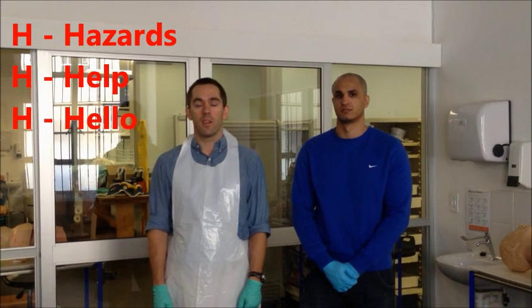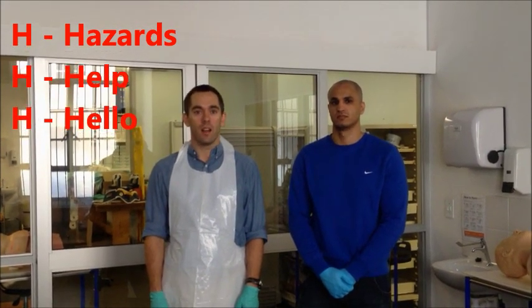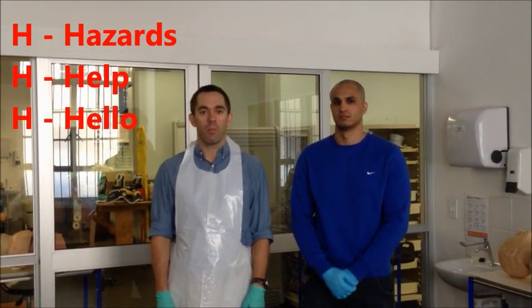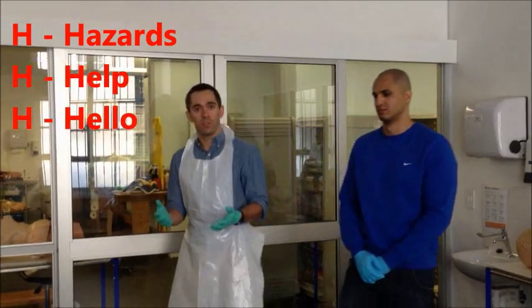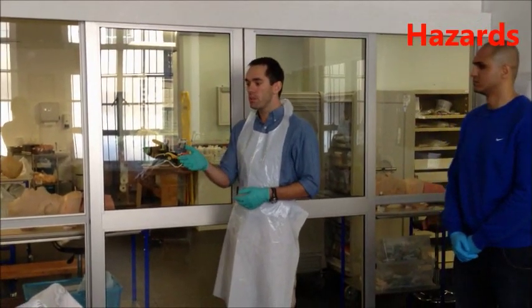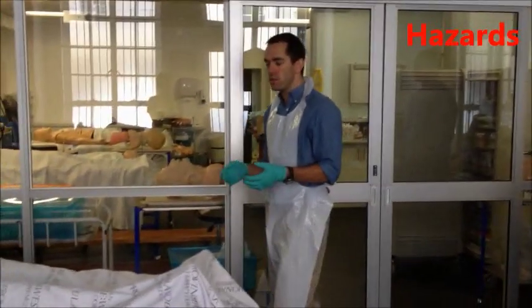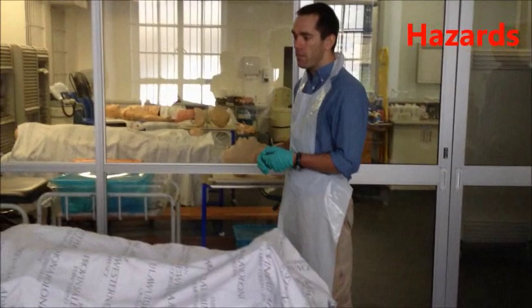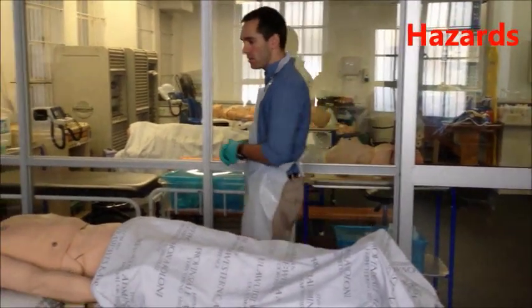The BLS sequence starts with the three H's: hazards, hello, and help. For hazards, I've done universal precautions, and as I approach my patient, I make sure the environment is safe for myself, the patient, and my assistants.